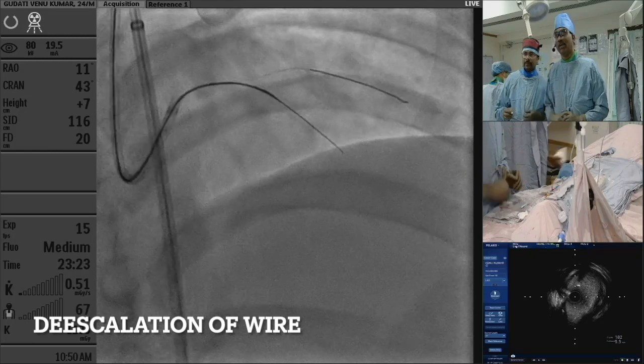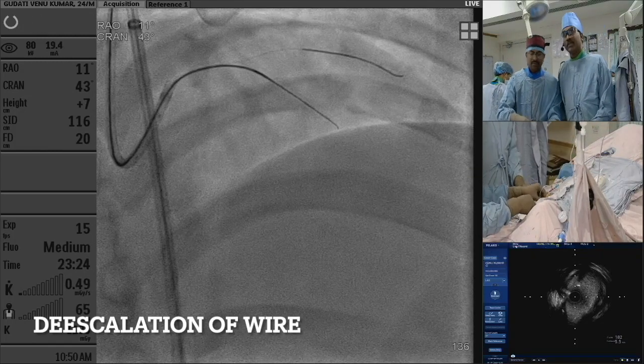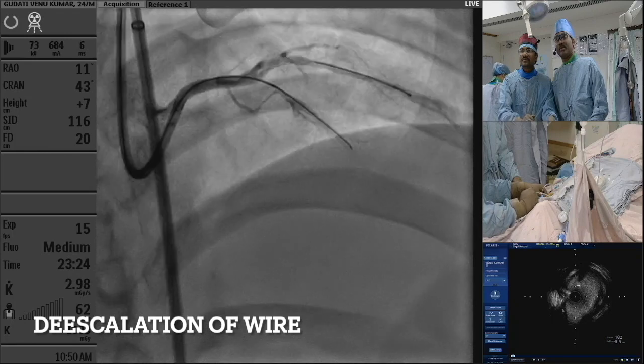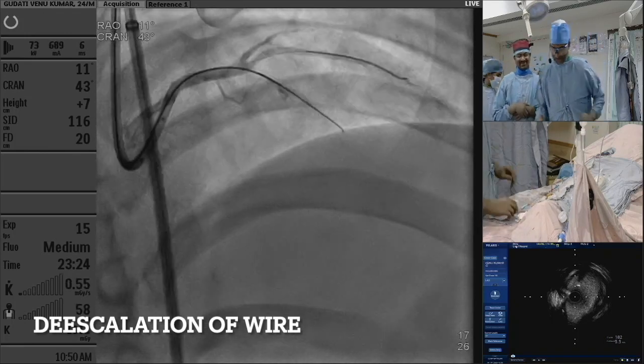Just check. No, wait. So it just slipped into the vessel, it seems. So, yeah, just check. Wow, that's great.